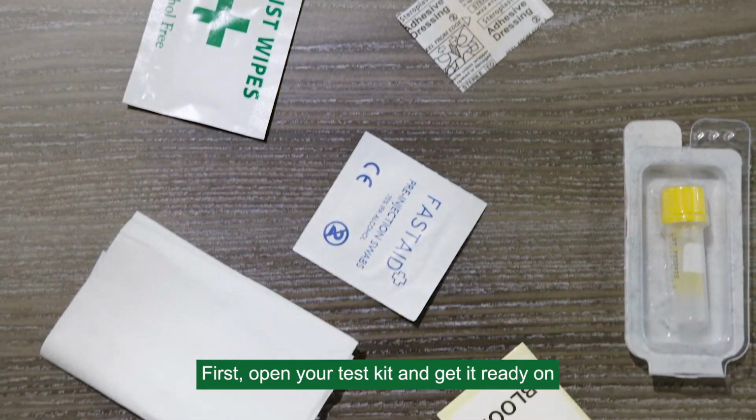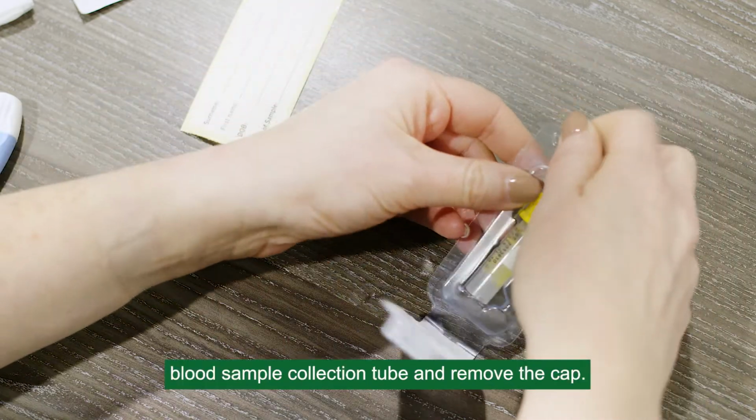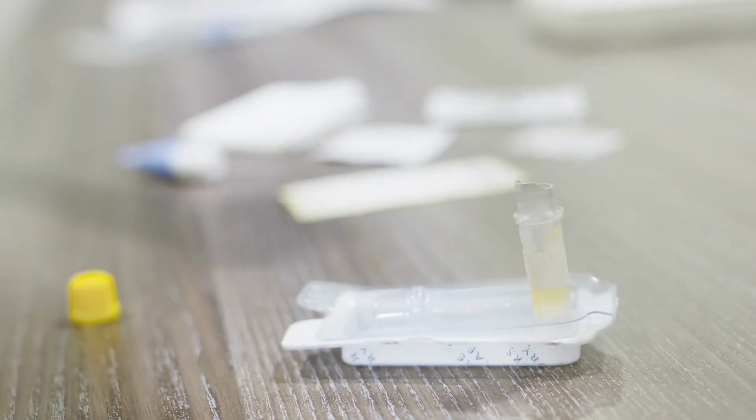First, open your test kit and get it ready on a clean, flat surface. Ensure you take out the blood sample collection tube and remove the cap. Stand it securely in the closed packaging.